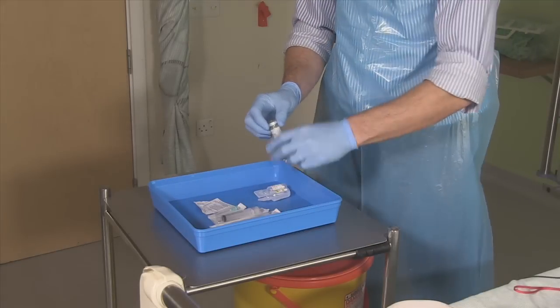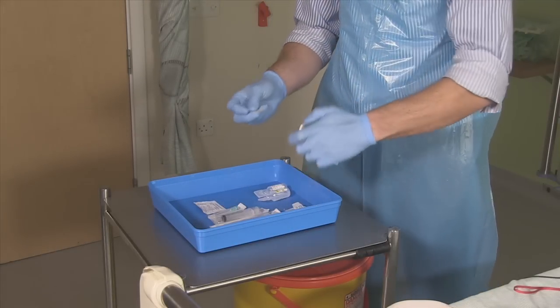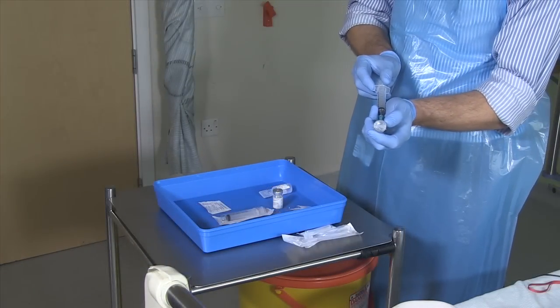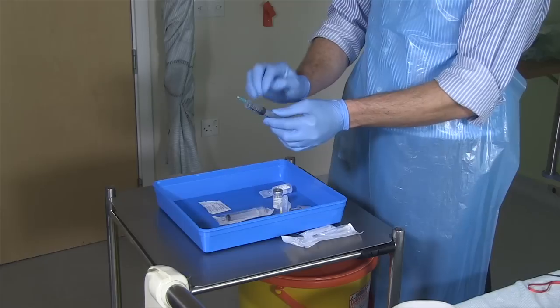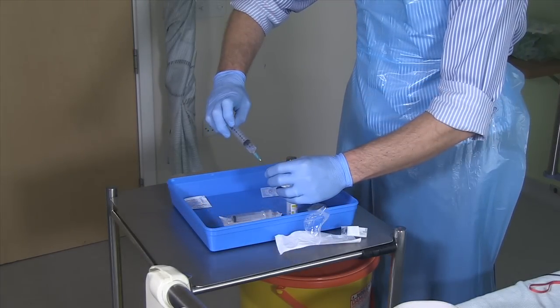Remove the cap from the vial and swab the rubber bung with a sterilising wipe. Draw up the required volume of fluid for reconstitution. Remove any air bubbles by gently tapping the syringe barrel and then inject the right volume of fluid into the vial.